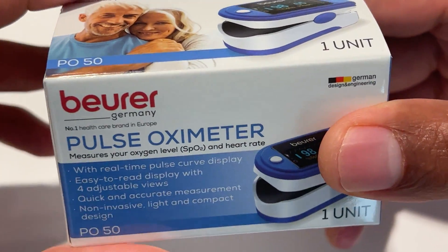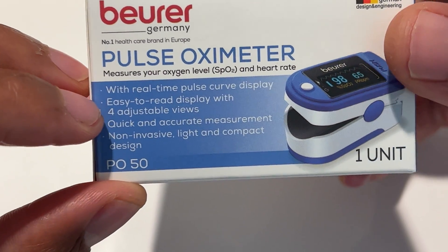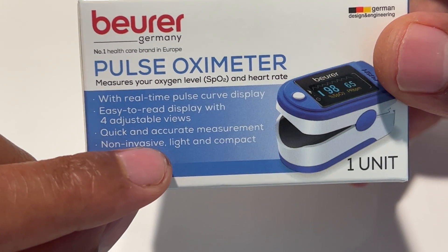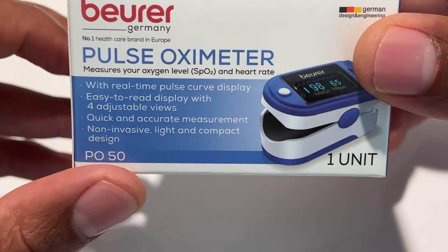I'm going to open it up. There's one unit that comes in a pack. It says with real-time pulse curve display, easy-to-read display with four adjustable views, quick and accurate measurement, non-invasive, light and compact design.